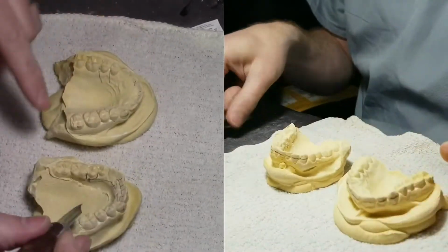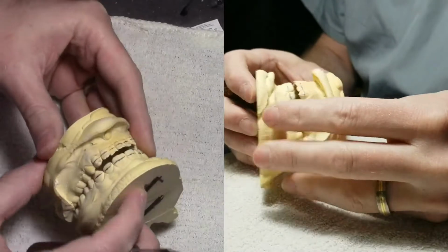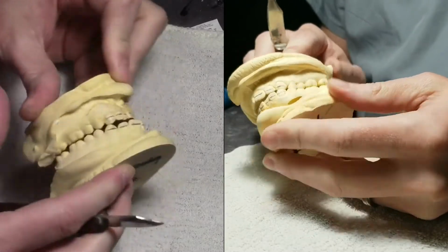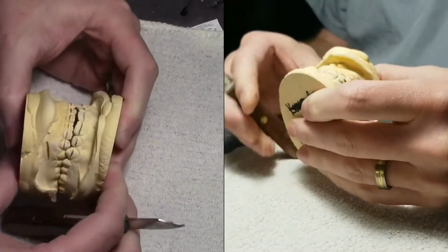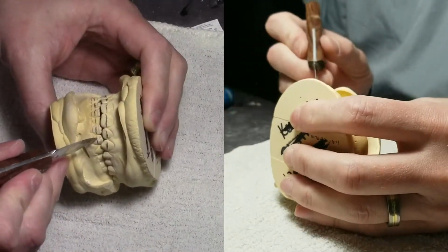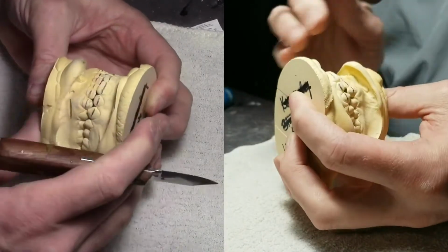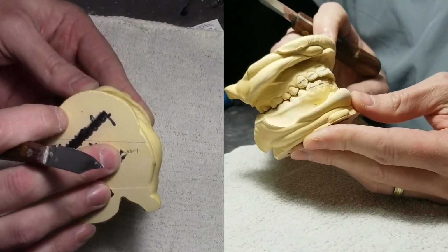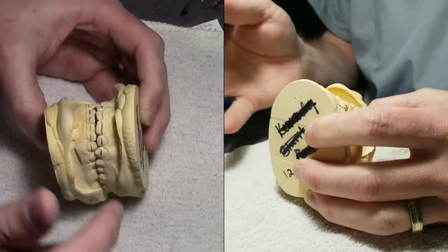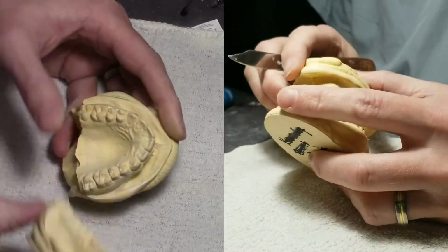So I've already picked off bubbles on the occlusion so I can get them to seat together better and get a good idea. You can see how they sock in the occlusion right there. And then I think I'm going to have to reset 2 to 2 and maybe include this canine right here. You can probably see it's sticking out. It's in crossbite a little bit. So I may include that, but I'm not going to change the design of the spring. The spring will have enough quote-unquote spring to it. It should be able to pull that in. And this will just be a regular one.